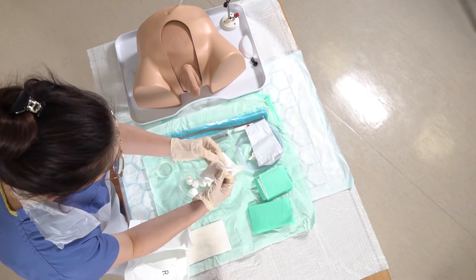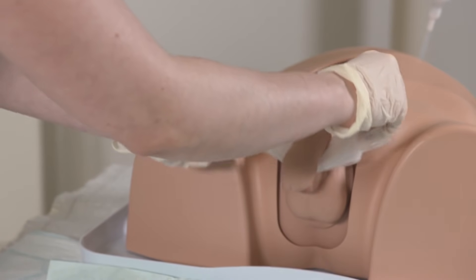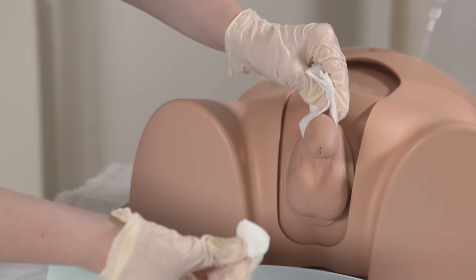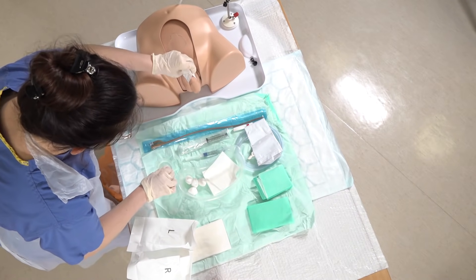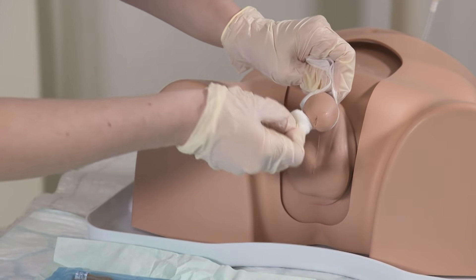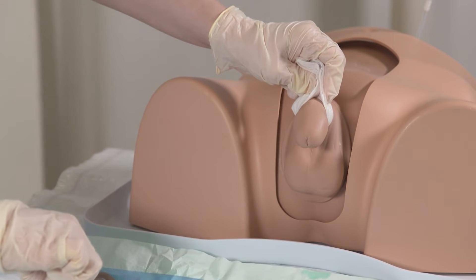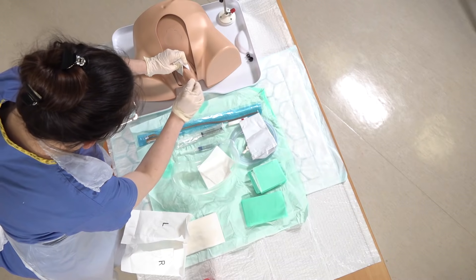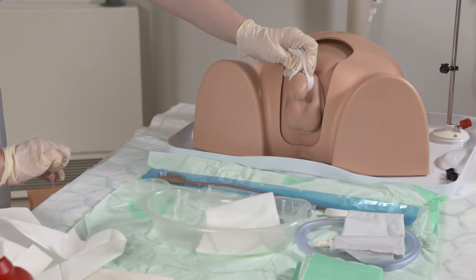We're going to use a piece of gauze to act like a sling around the penis to hold it up. Then with my other hand I'm going to use cotton wool balls dipped into normal saline to clean in circular motions, starting around the urethra and discarding after each use — just in circular motions and then place them to the bin.